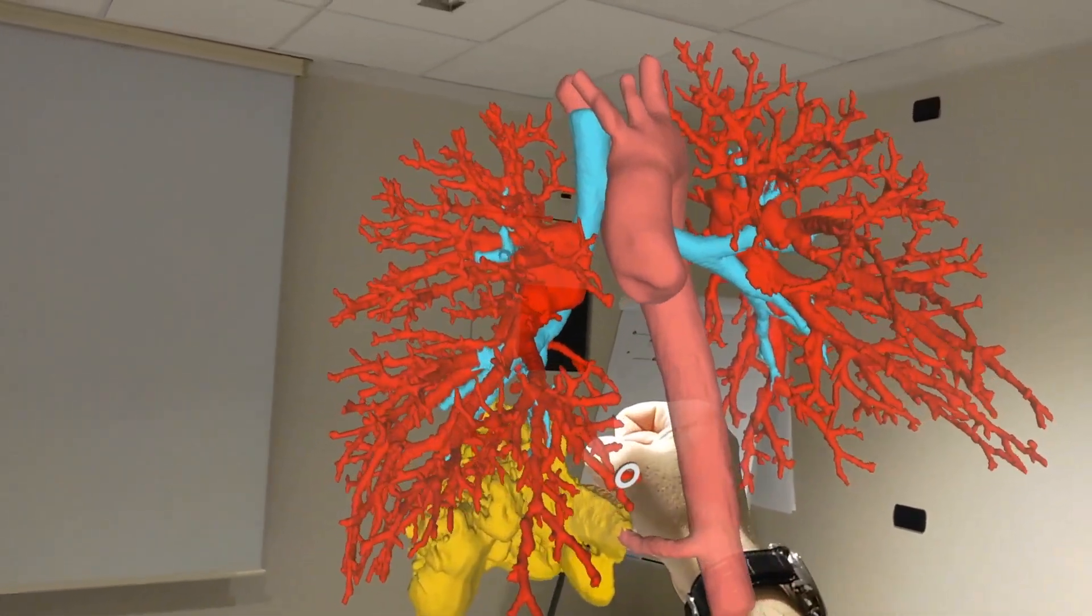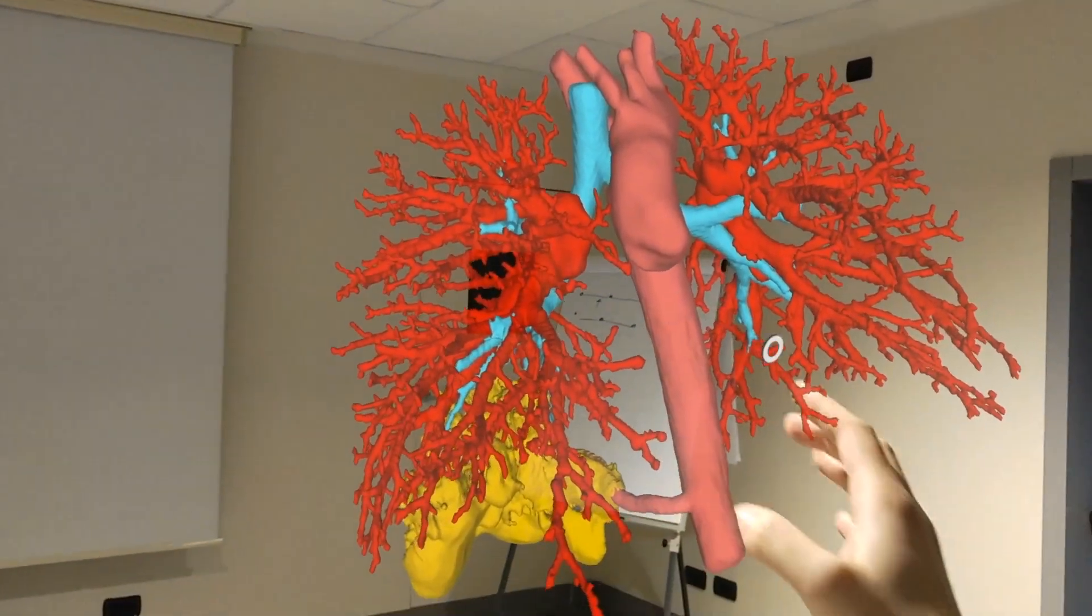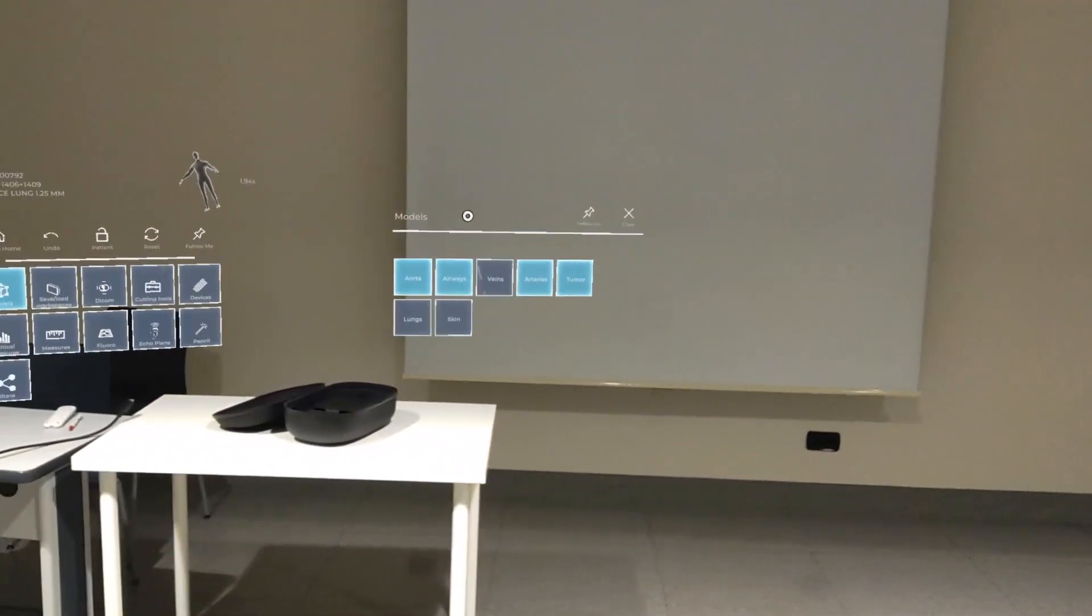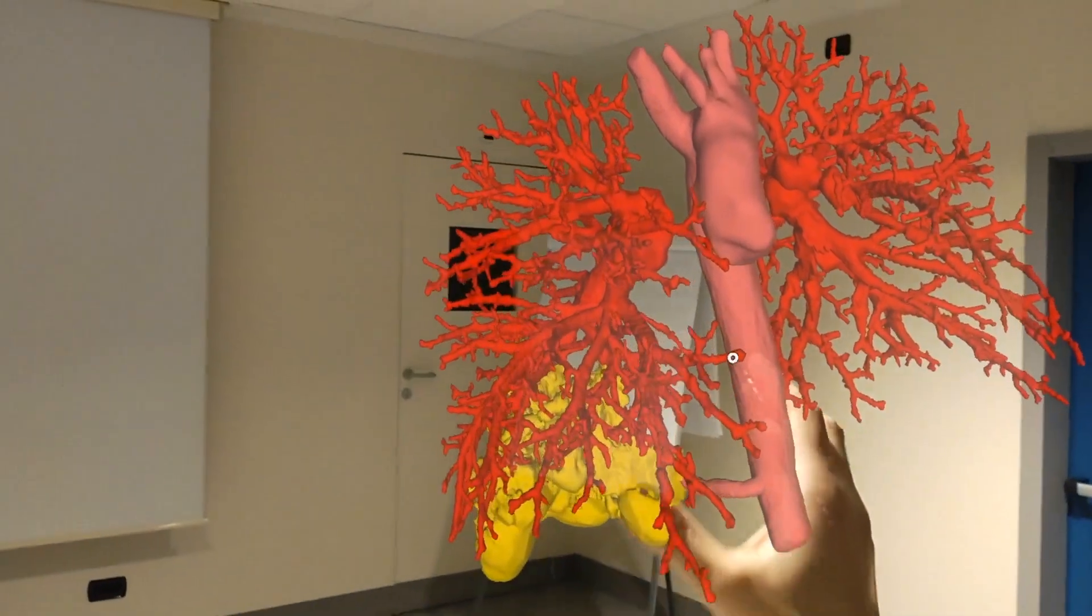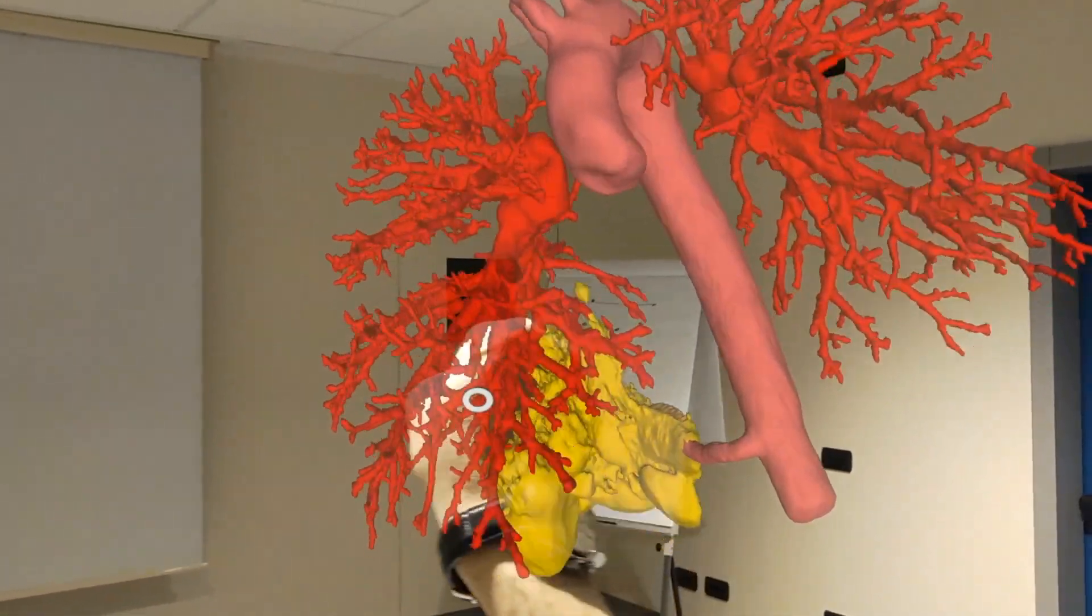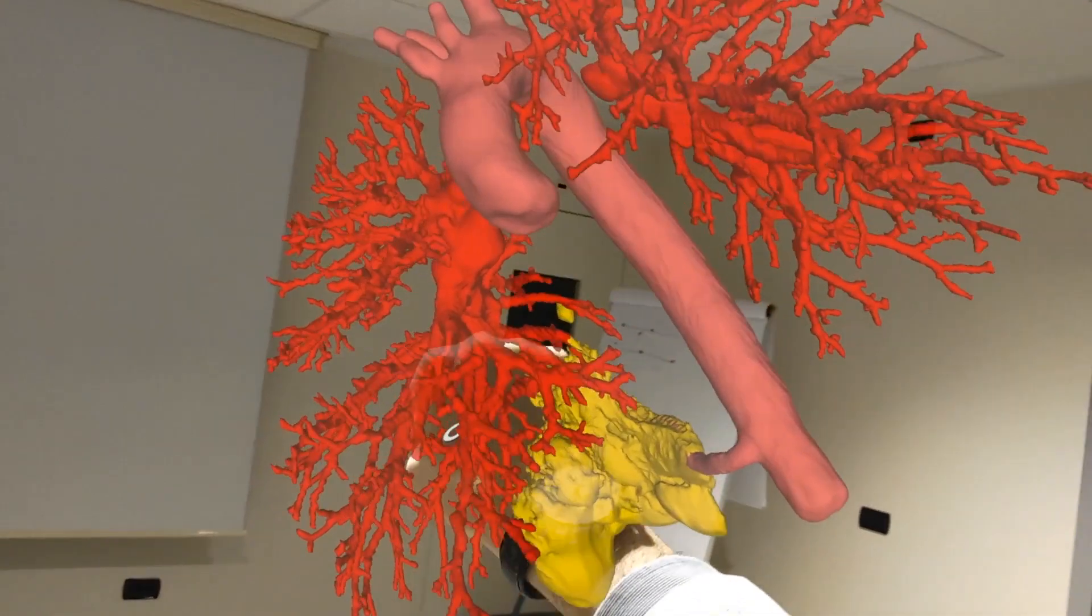Thanks to the holographic reconstruction based on preoperative standard CT scan, we were able to stretch and rotate the whole image to better visualize all vascular structures.